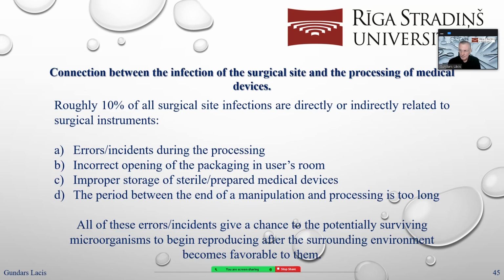It can happen even with a perfect reprocessing process that if the starting amount is so huge, after this process the rest is quite enough for a new infection. It can happen.